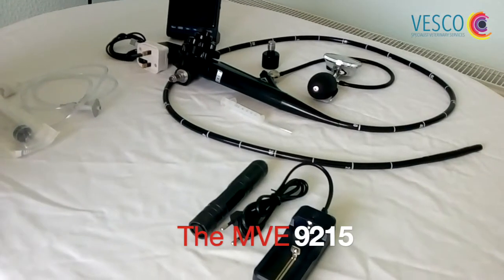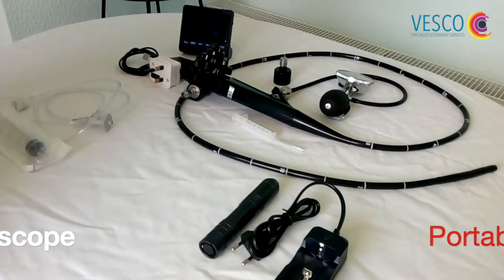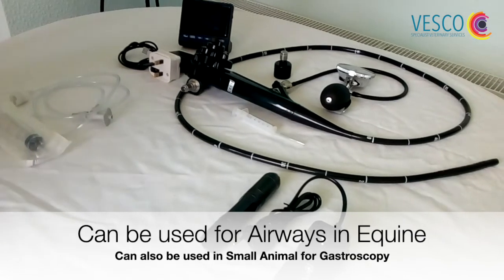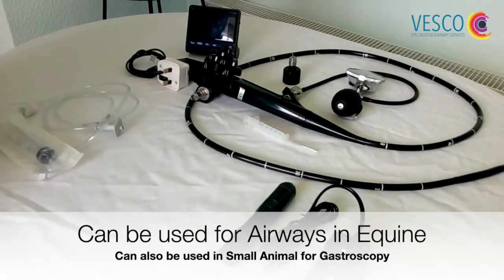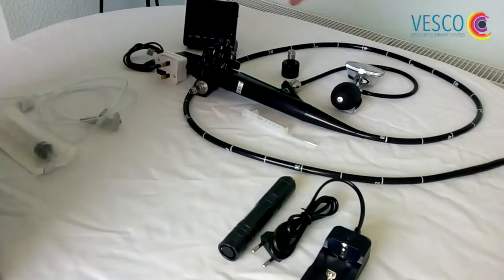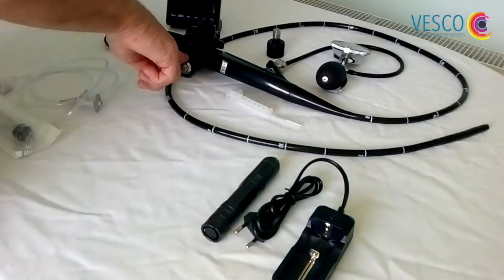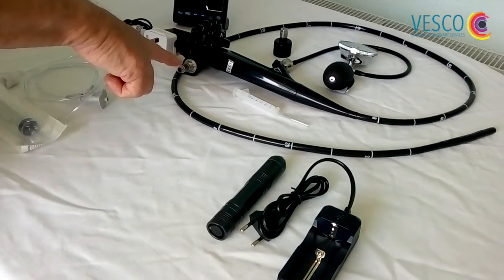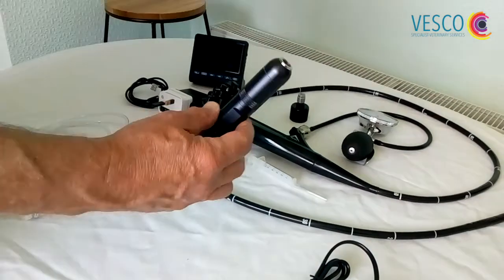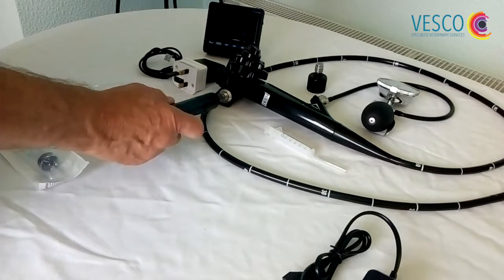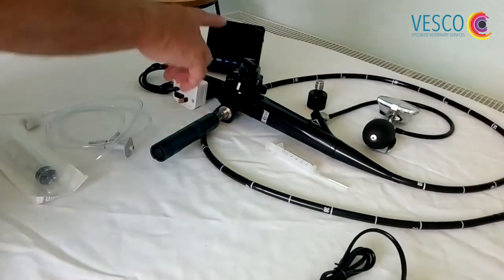We have the MVE9215, which is a portable video endoscope predominantly for use in upper respiratory work in equine. There are several subtle differences between this and your normal video scope or standard fiber scope. Here's the main scope itself with the control body and patient tube. Crucially, it doesn't have the big heavy umbilical cord which needs to be connected to the light source. This is actually a 10 watt LED light source which screws onto the light guide post. It's super bright and gives you really good image quality when you view it through the viewing screen.